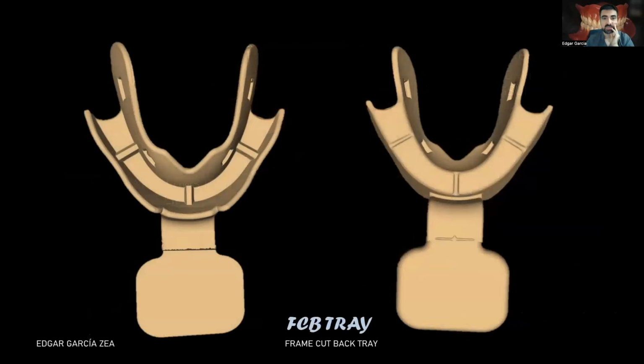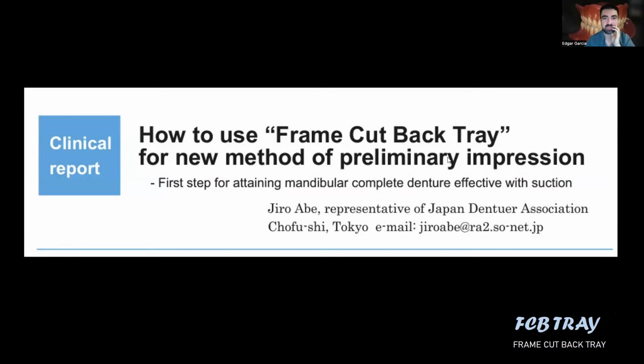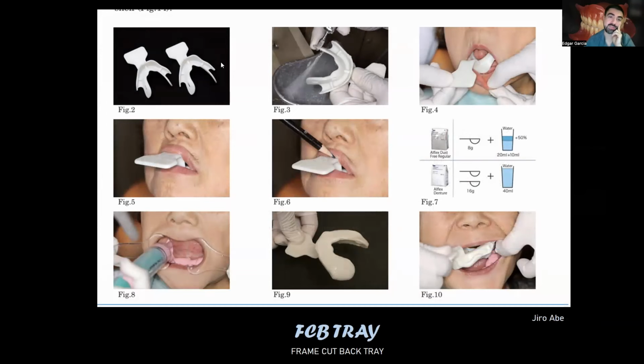The impression technique using this tray is super easy, as Jiro Abe presented in his article. You can modify it if it's too big or too long, but he also says that it doesn't matter if you don't have a special alginate to use it.